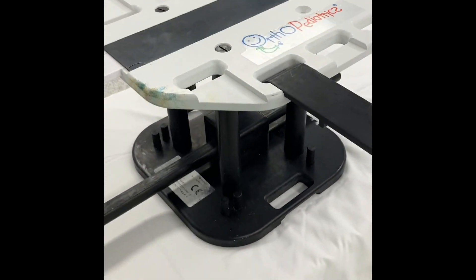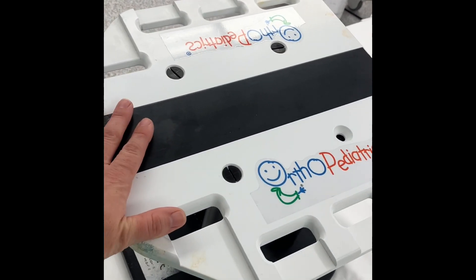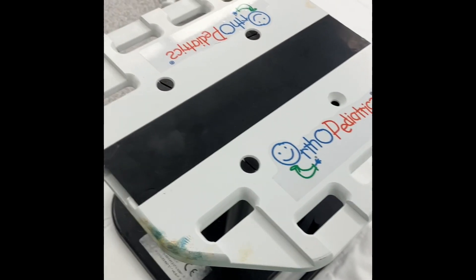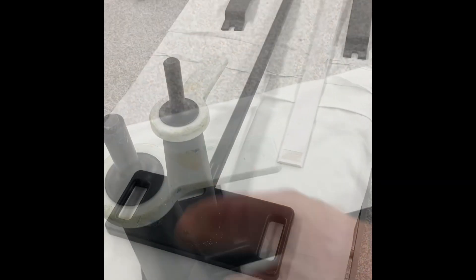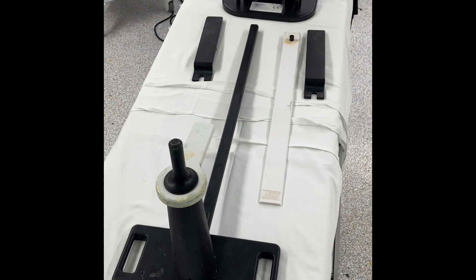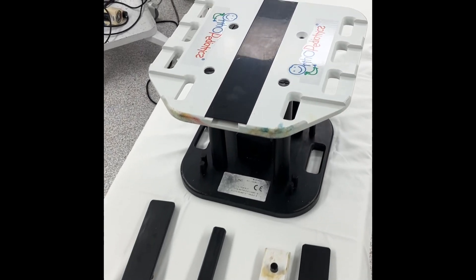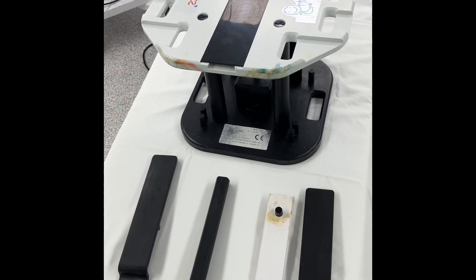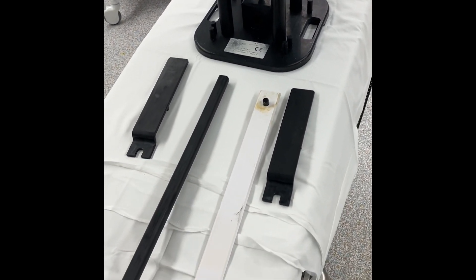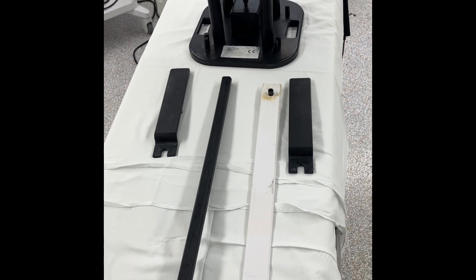Now let's go gather some supplies and get ready for our patient. This part is the main body of the bed, but the patient will actually be laying on this bar here. This is our spica table — there are five pieces to it, and it just goes right on top of our OR bed. It's radiolucent, so we will be able to take x-rays during the case to make sure that we have a good reduction of the femur.